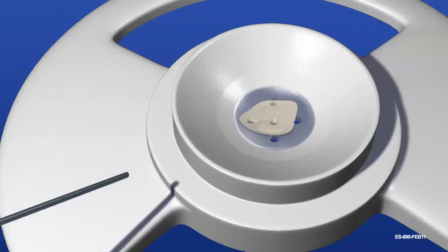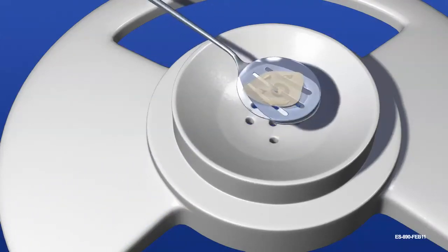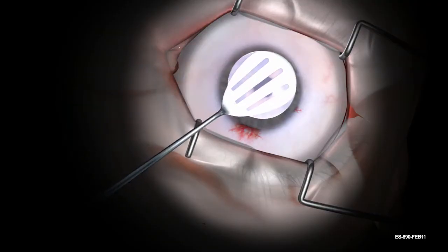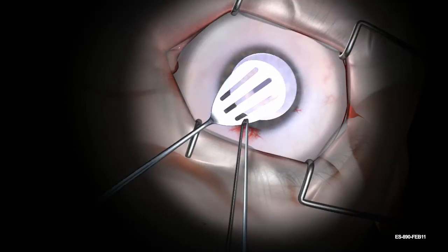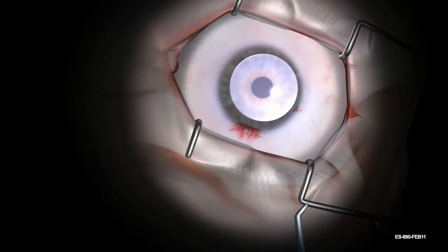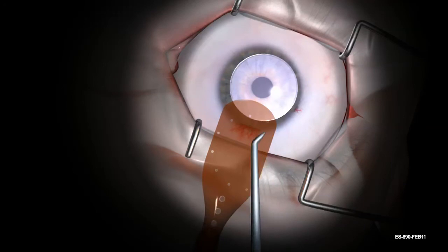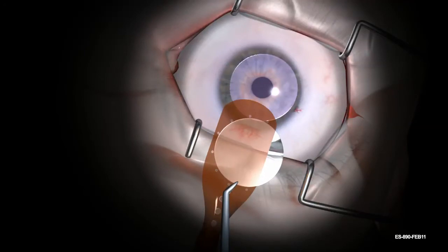Apply a small amount of cohesive viscoelastic to the endothelium. Use a spatula to load the tissue onto the carrier endothelium side up. Set the donor tissue within the boundary of the alignment holes on the carrier. Larger diameter allografts will overhang the carrier on the open side of the alignment holes. Do not allow donor tissue to extend past the front end of the carrier.